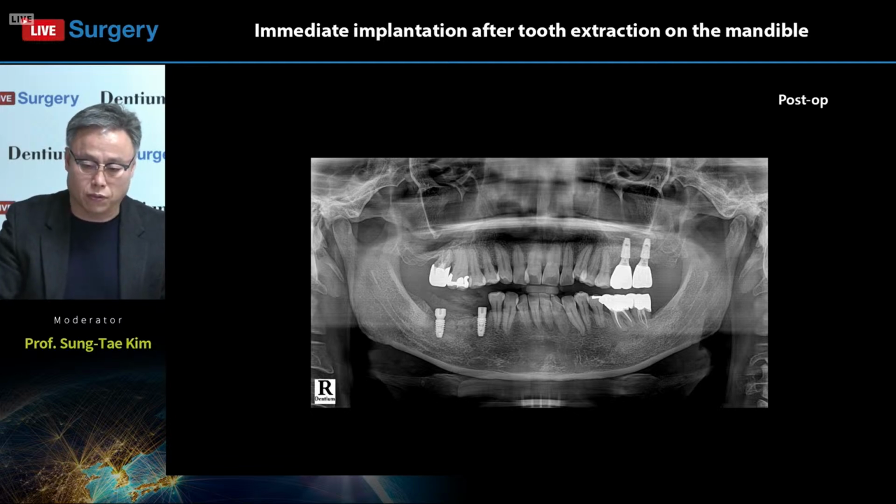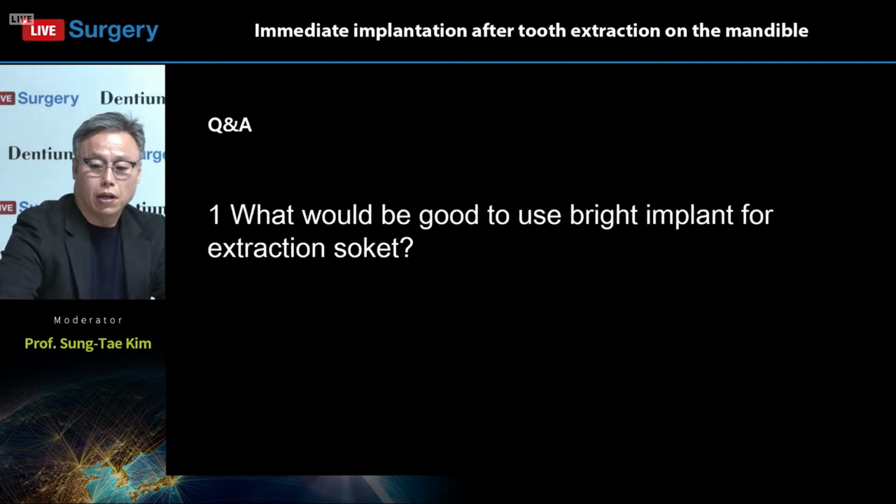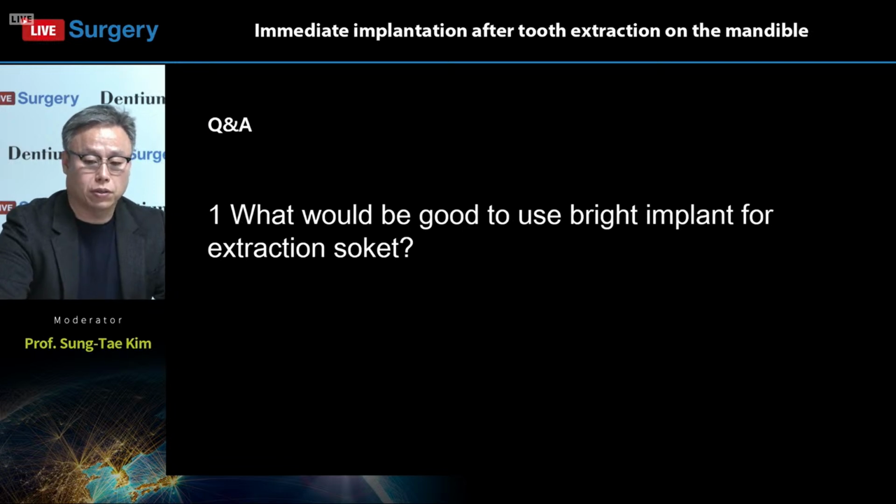One is the thickness of the fixture increased, and the other is the connection. That's the advantage of the bright implant. And I think there's no more question about that.